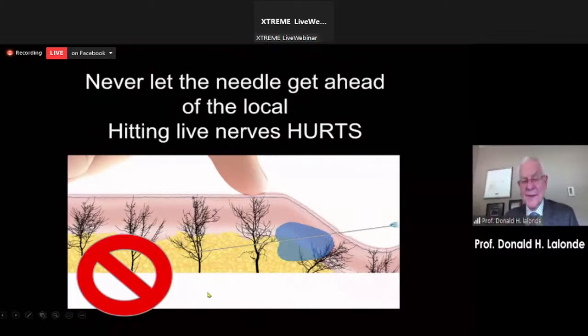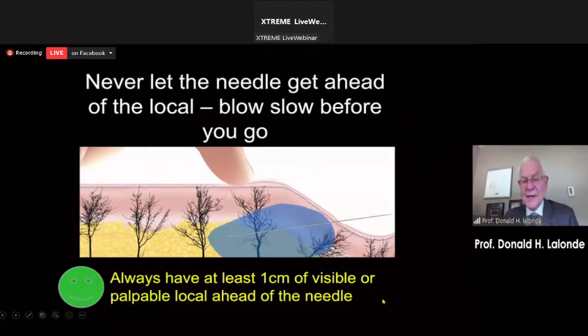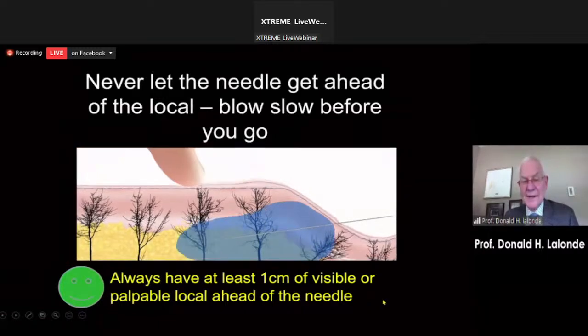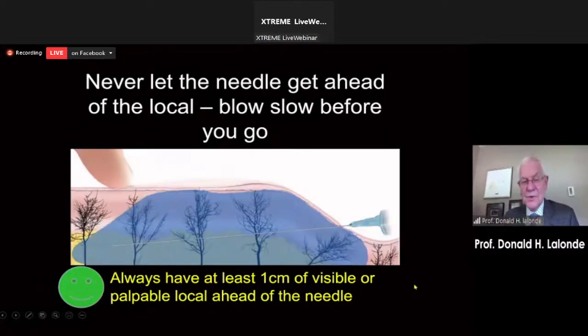And this is a bad thing to do. You never have your sharp needle tip going into live nerves. Instead, you always have at least 1 centimeter of visible or palpable local anesthesia ahead of your needle tip. And you're feeling it with your index finger of your left hand as you advance. And always in my head, I'm thinking, blow slow before you go. Blow slow before you go.